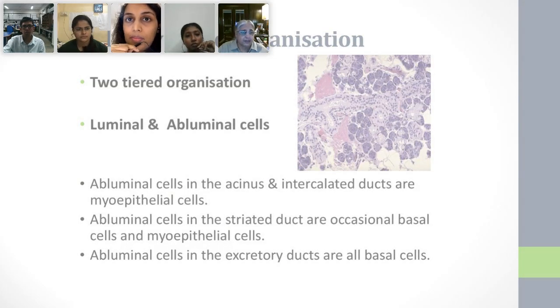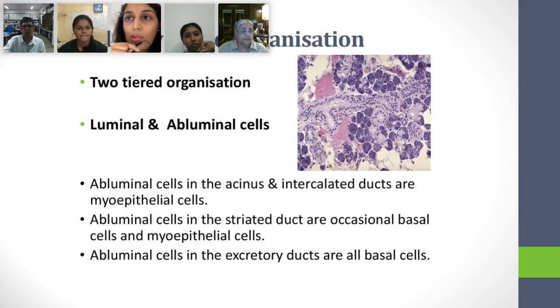Is it a minor salivary gland? Did anybody think it was a minor salivary gland? I was saying that it can be either minor or submandibular. Why? What are the minor salivary glands? Seromucinous? Yeah, but they are predominantly mucinous. So I would go for major only. So which major? Submandibular. So yeah, it is the submandibular. There is no other argument about it.